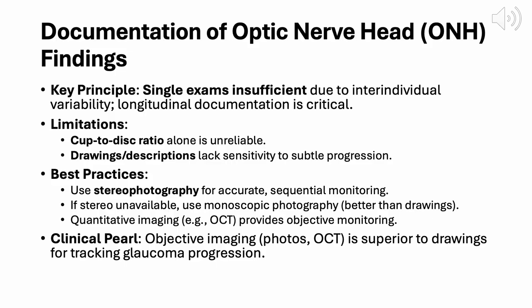Whenever possible, use objective imaging, especially photos and OCT, over drawings. These tools offer a more reliable way to track glaucoma progression over time.